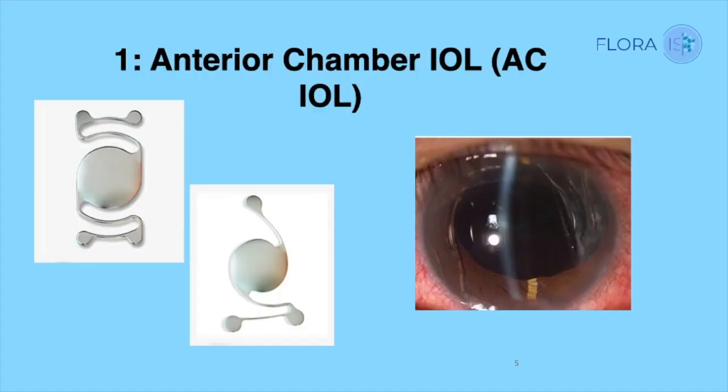Now let's look briefly into AC IOL. I know most of us are very familiar with this lens. Allow me just to highlight a few issues pertaining to this lens for the purpose of discussion. As we know, in an experienced surgeon with a good AC clearance of the vitreous and lens matter, patient can still attain good visual outcome with this lens.